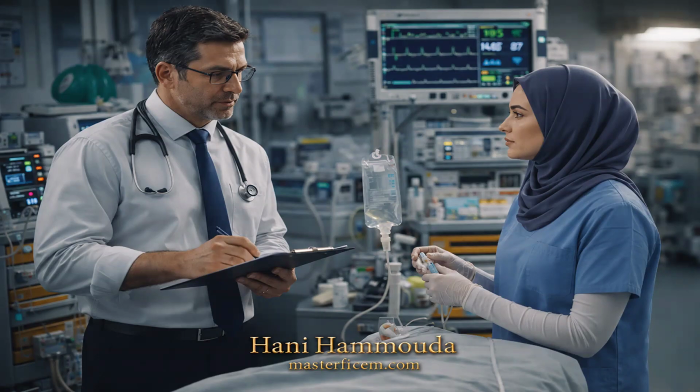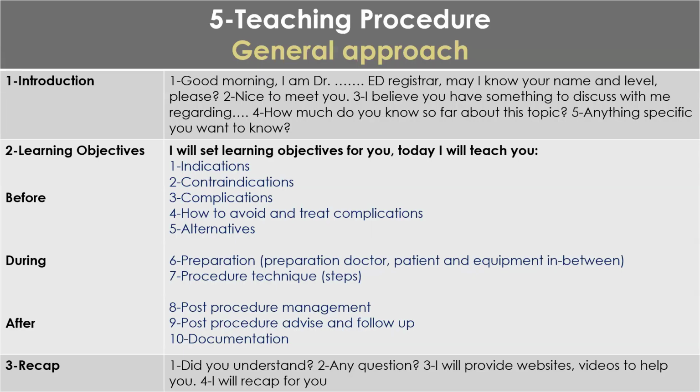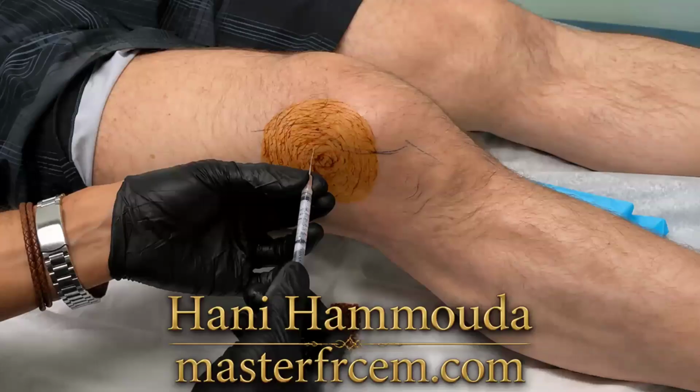Preparation. You need at least one doctor and one nurse. Remember to wash your hands and don your PPE. Go to the patient, explain the procedure to the patient, take consent. Patient is lying supine, and then you have the knee extended to 25-degree or semi-flexed.